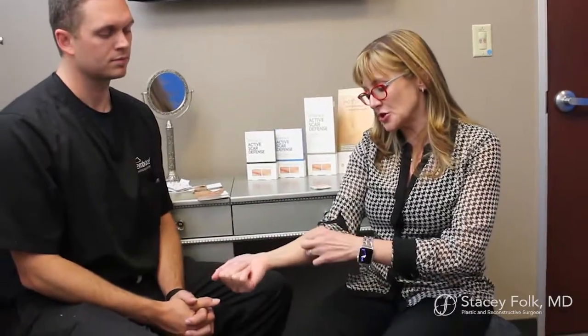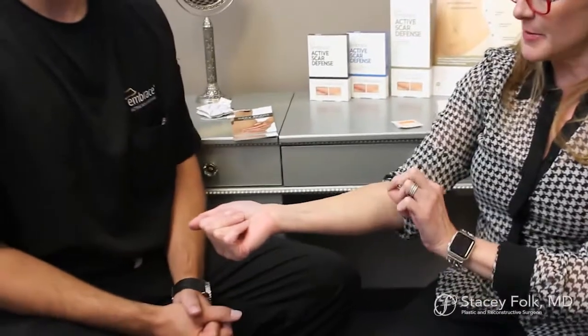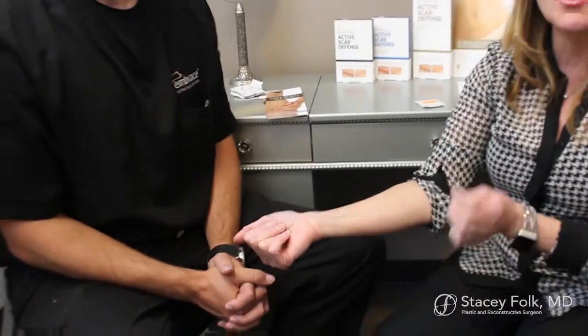What you want to do is start in one corner, gently lift, and use soap and water underneath it, maybe baby oil or an adhesive remover. And then you want to leave it off for 12 to 24 hours to let your skin breathe. There are some tricks if you have an incision underneath your breast from a breast reduction or a breast lift. You want to pull up on your breast and apply it, and you want there to be more on the bottom of your breast than on your chest wall. So you wouldn't line that one exactly over the incision, but go just a little bit higher, okay?